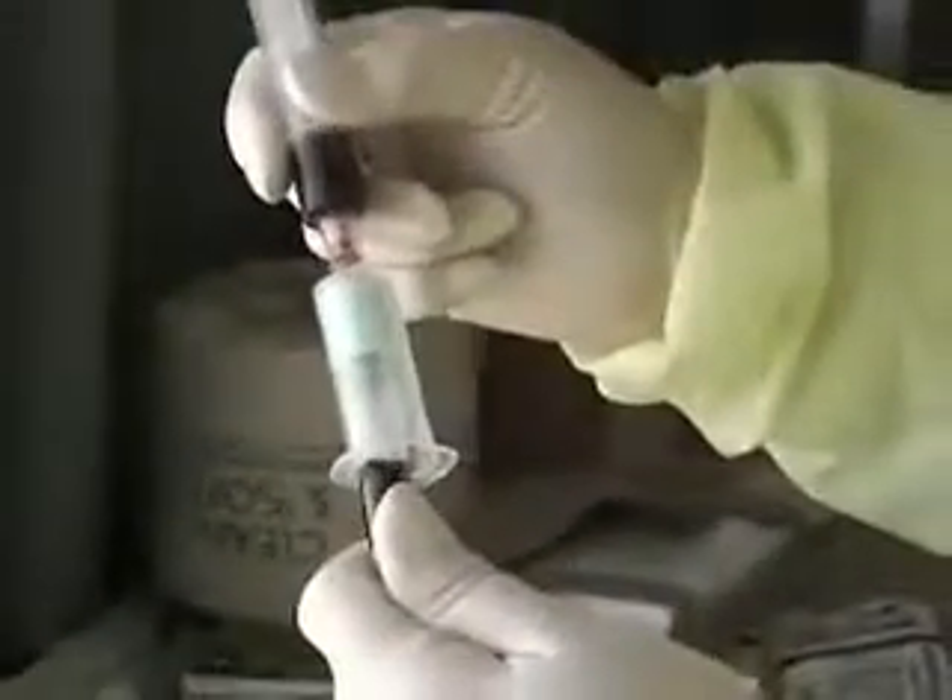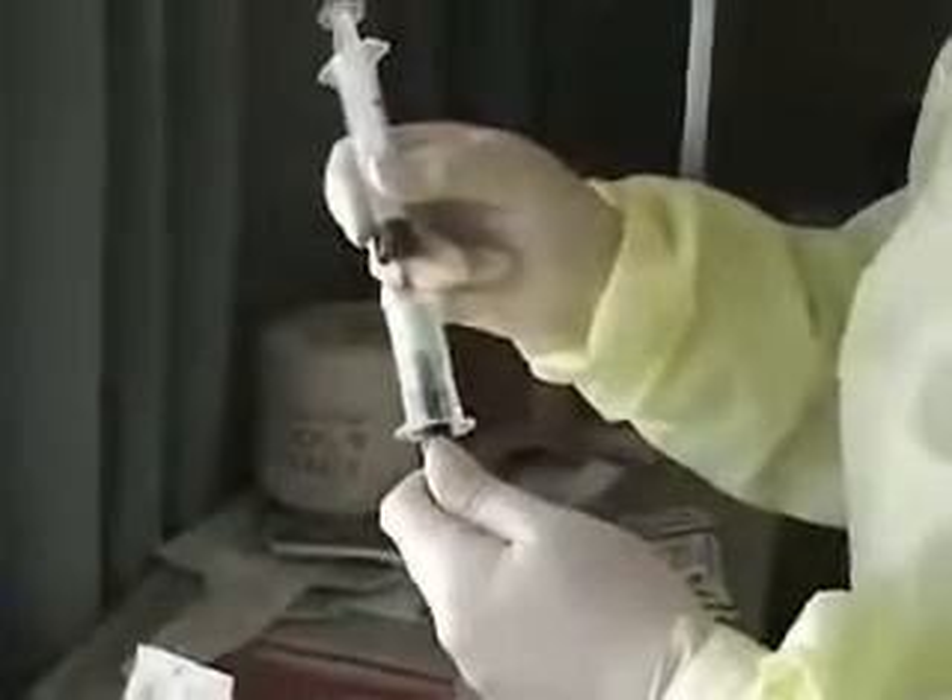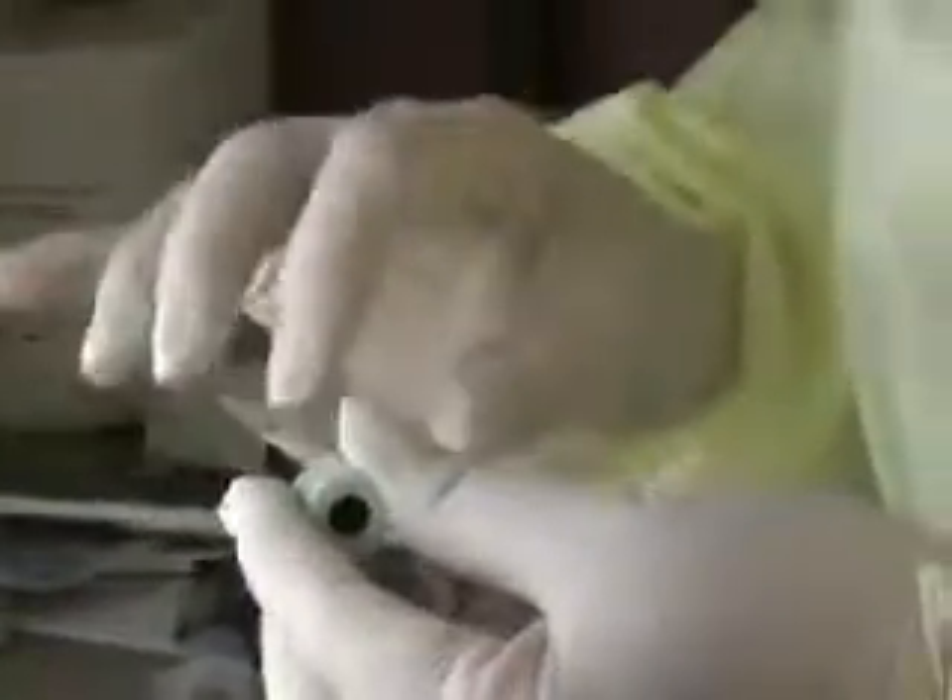That's our sample, and we'll use the transfer to put it into the vial. I couldn't feel that you stuck me to draw blood! I didn't have to stick you — that's why we did this. So we didn't have to stick you — that's nice! This is the transfer to the vial. The lab should give you the transfer equipment as well. Then we have our sample — put the label on with the date and time, what the draw is for, the nurse's initials, and the patient's information. Put that in the red bag and send it by tube to the lab.